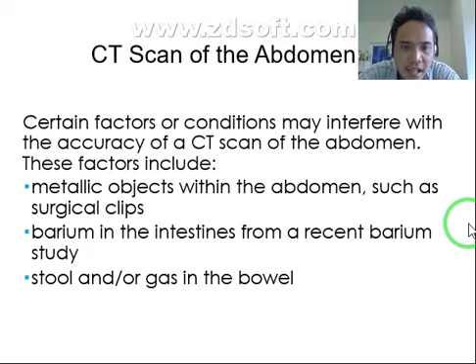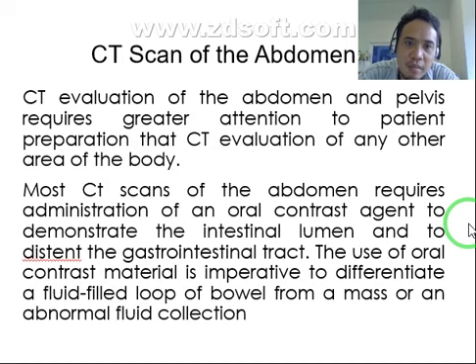Okay? Stool or fecal materials or gas in the bowel may interfere with the accuracy of CT scan of the abdomen. It's because pwede mo camouflage diha katong mga pathologic disorder sa tuong tiyan. Okay, so the CT scan technologist must instruct the patient to do fasting and cleansing of the bowel. Okay, so CT evaluation of the abdomen and pelvis requires greater attention to the patient preparation than the CT evaluation of any other areas of the body.